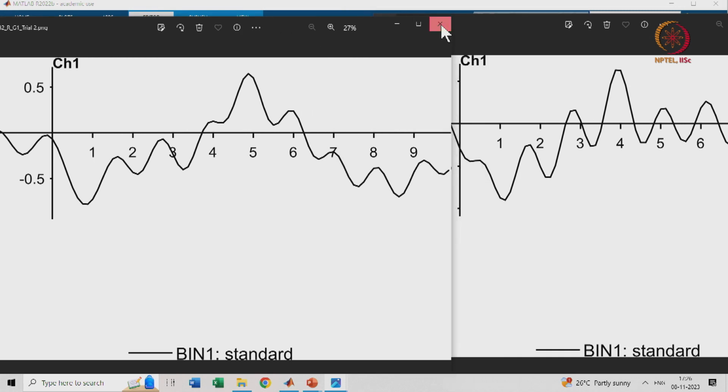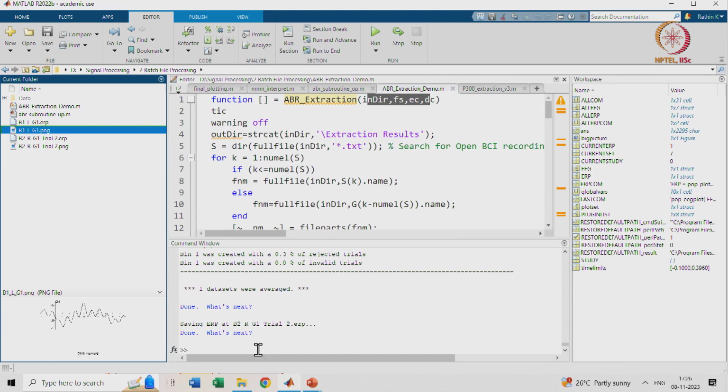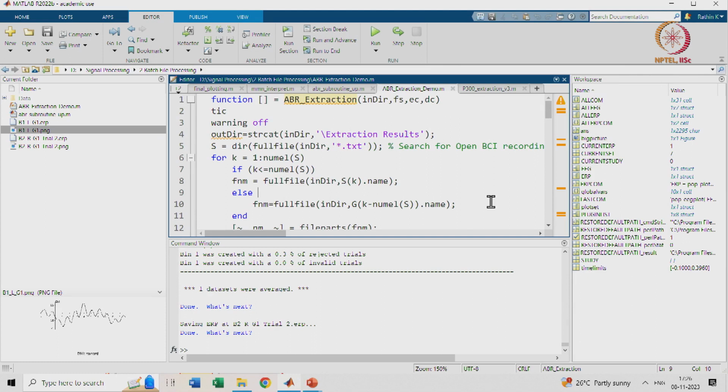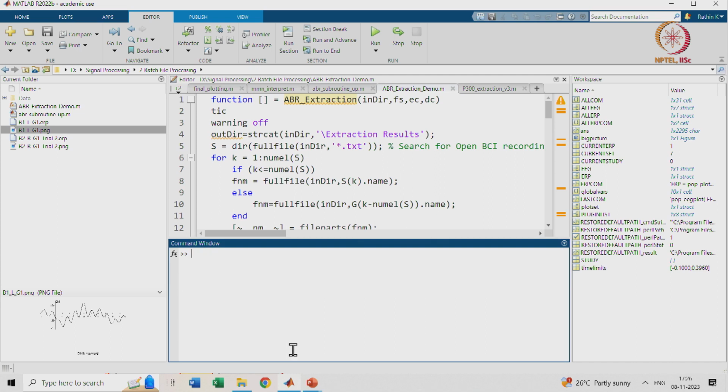So our first approach was to use the GUI and do it. It is good for research purposes. It is good when you have very few steps to process. But for problems like this, where it is very difficult to process everything one by one, we should go for some other approach than that, batch file processing, and that is why I thought of showing you this particular ABR example for batch file processing, right? So this is also another aspect of that.